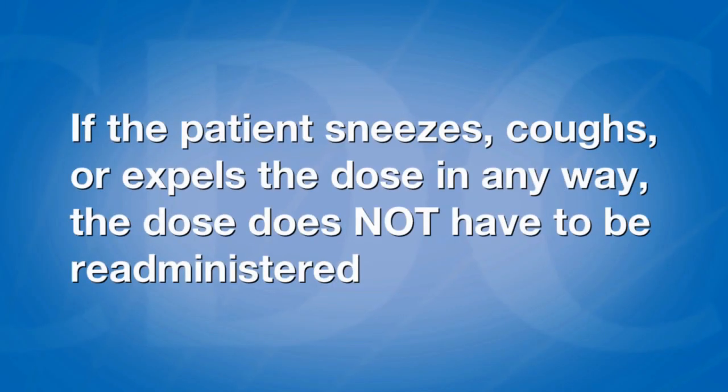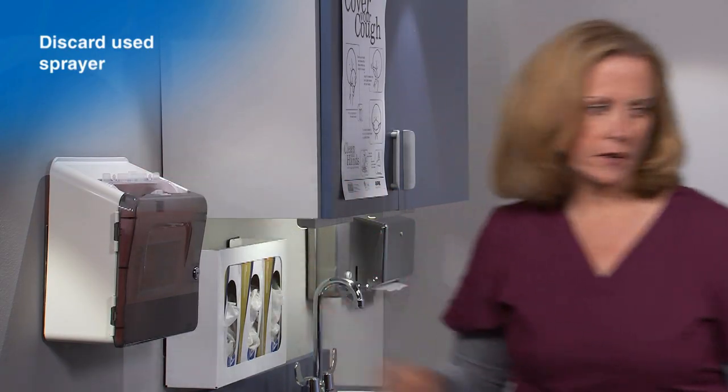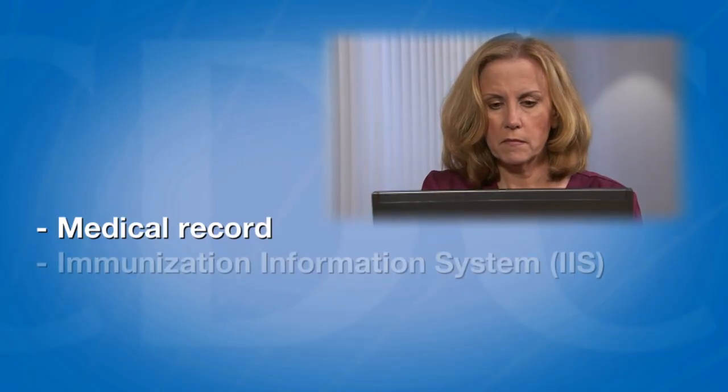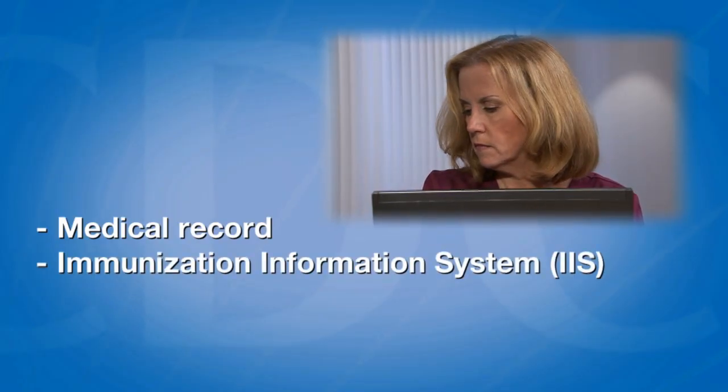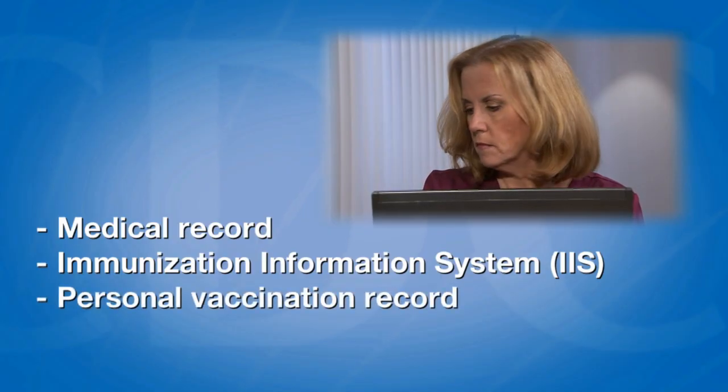If the patient sneezes, coughs, or expels the dose in any way, the dose does not have to be re-administered. Discard the used sprayer into a biohazard or sharps container. Next, document the dose in the medical record, the immunization information system, or IIS, if applicable, and the patient's personal vaccination record.